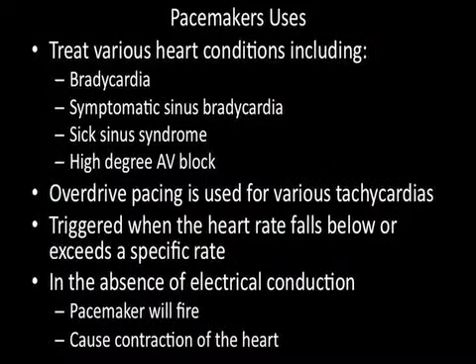Pacemakers are used to treat various heart conditions including bradycardia, symptomatic sinus bradycardia, sick sinus syndrome, and high-degree AV block. Overdrive pacing is used for various tachycardias. It can be triggered when the heart rate falls below or exceeds a specific rate. In the absence of electrical conduction, a pacemaker will fire, causing contraction of the heart.